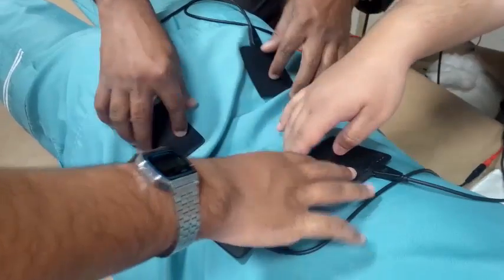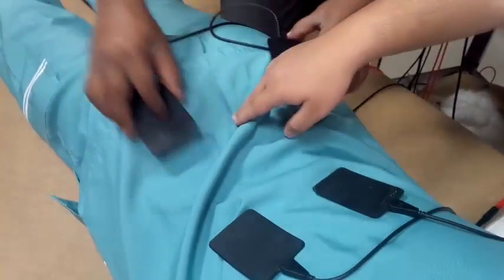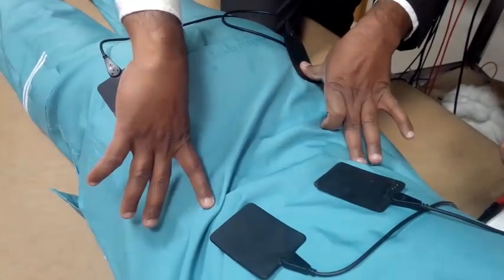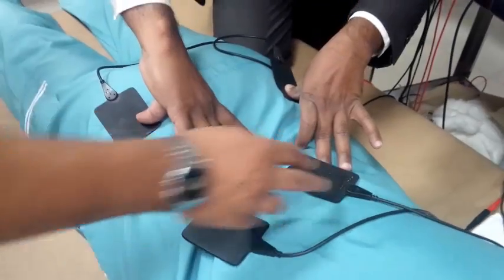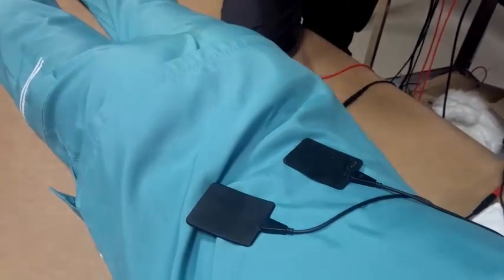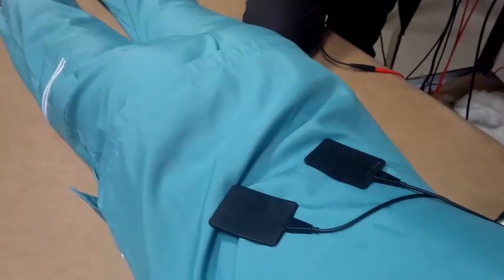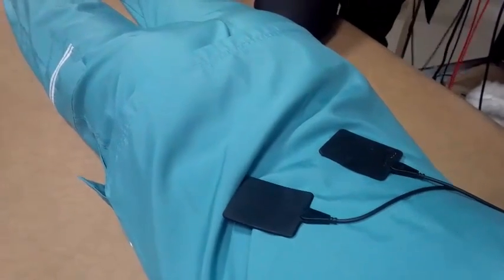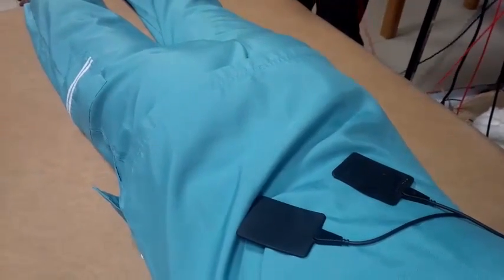Here or here. Here, in the middle. Okay, if we have pain here, place it like here, a little bit, so that it intersects on this area. Okay? Right? So that's where you use your little brain. And then the hamstring muscle, again the same way. Say for an example, here there is a pain. The same way I can use it anywhere.